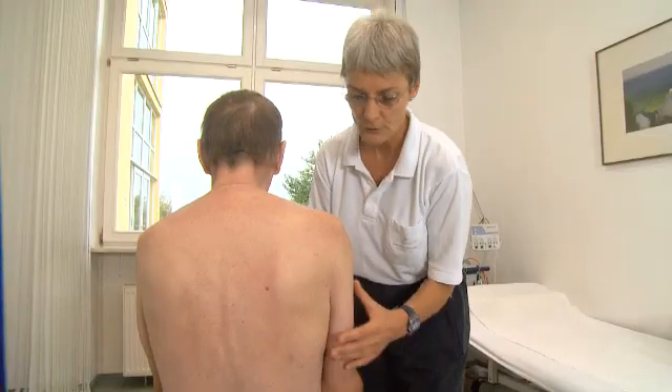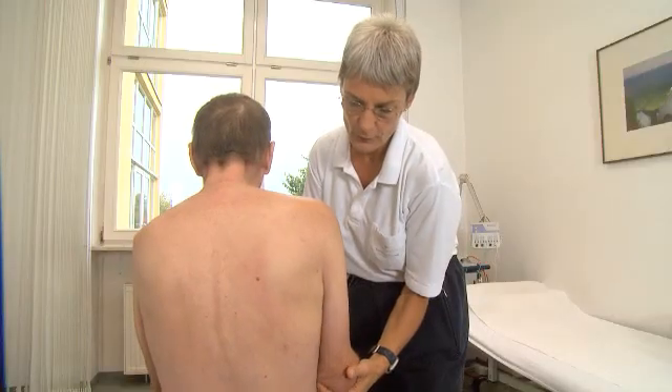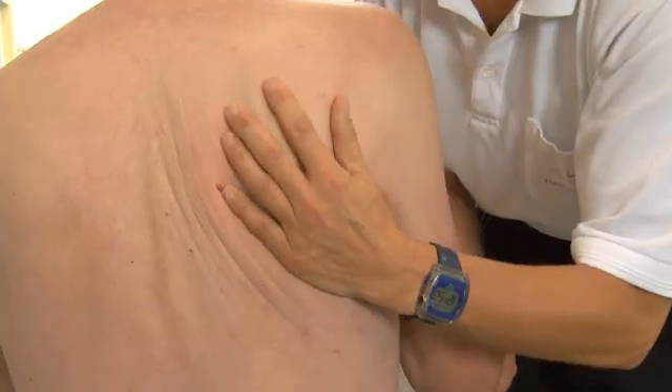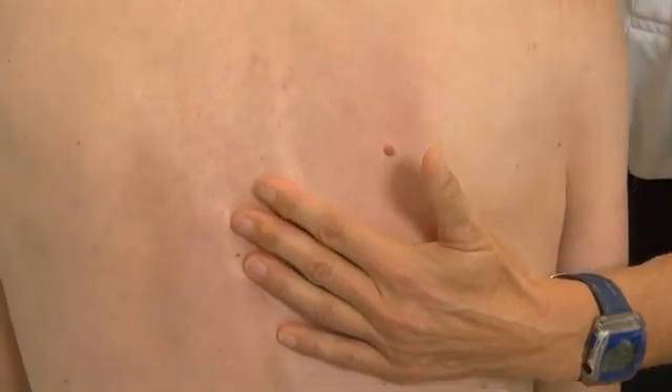For this patient, I would recommend the Omo-Nurexa because the joint gap is minimized, centering of the humerus is improved, the scapula is held in adduction more securely, and extension of the thoracic spine is improved.